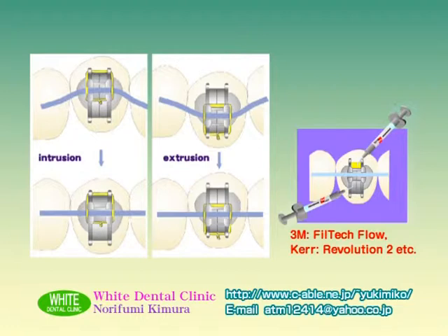When occlusion of the premolar is abnormal during closure of the interdental space, the higher level premolar than the ideal occlusal plane should be first intruded to align it with the ideal occlusal plane. The ligature wire is then detached to fix the bracket. For bracket fixation, a high flowable resin is injected into the gap between the bracket and the sliding plate from both the occlusal side and the cervical side.